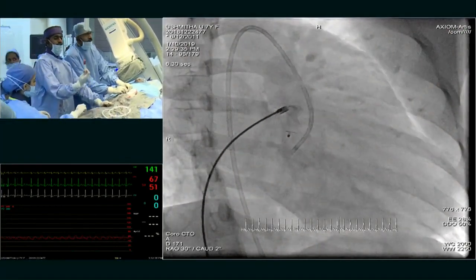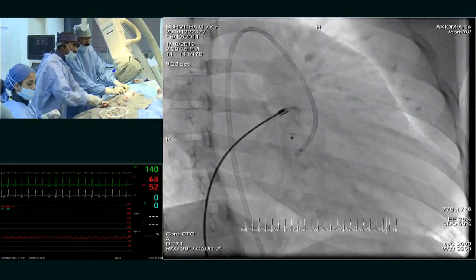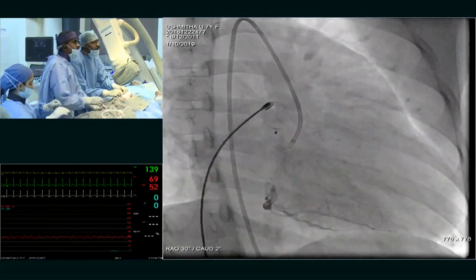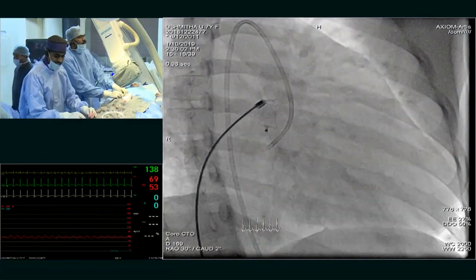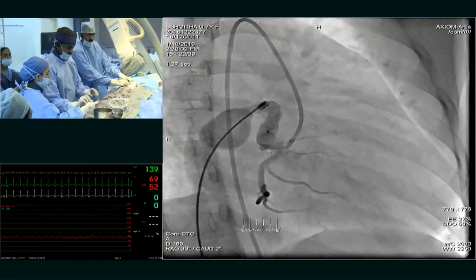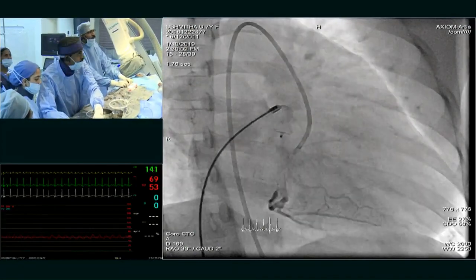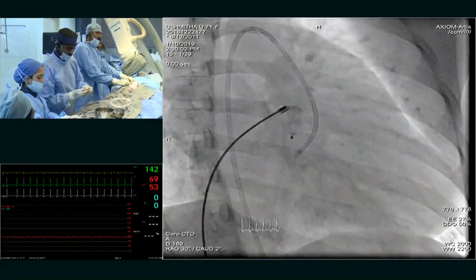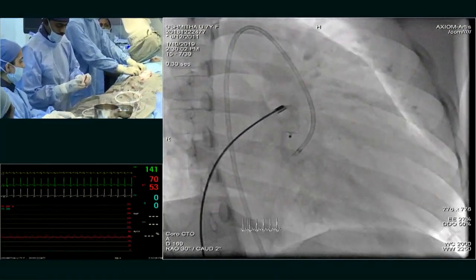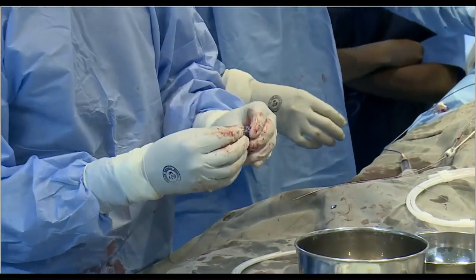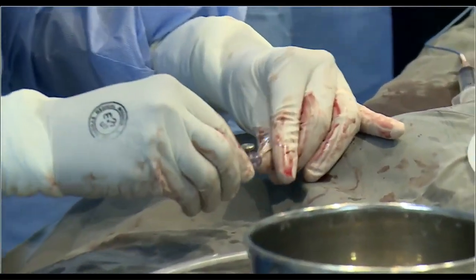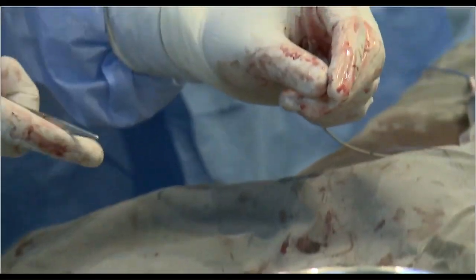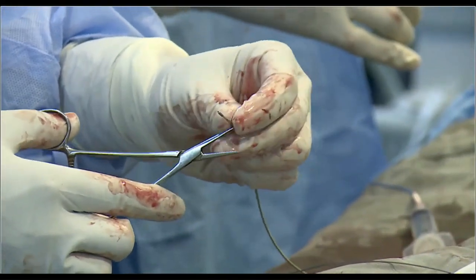Came back a little. If I am still on the vertical limb then I am okay. Right now what I am going to do is immediately release this one. Get me the screw. I am getting the screw — the screw is not working. BP is dropping because I am partially damping.